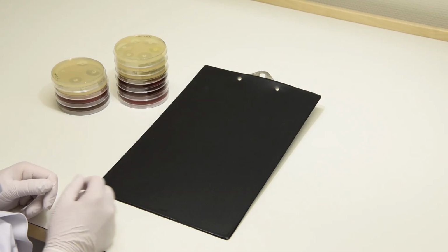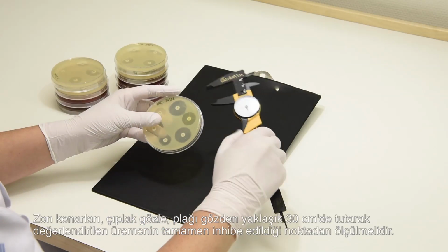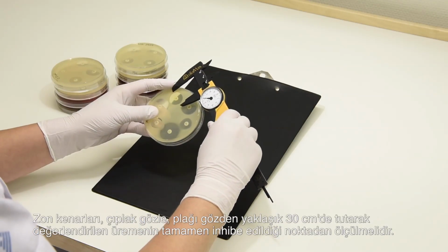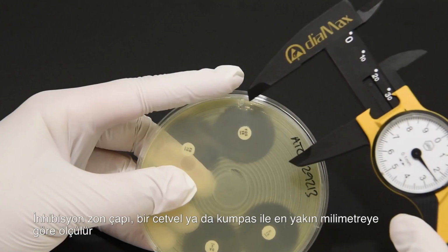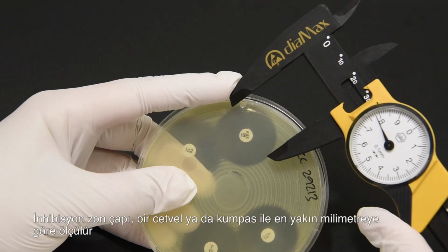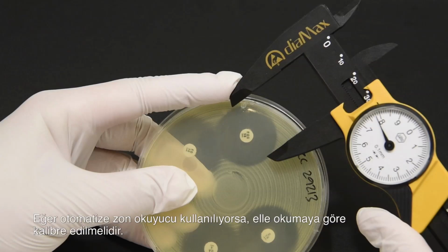repeated. Zone edges should be read at the point of complete inhibition of growth as judged by the naked eye, with the plate held about 30 cm from the eye. Measure inhibition zone diameters to the nearest millimetre with a ruler or a caliper. If an automated zone reader is used, it must be calibrated to manual reading.